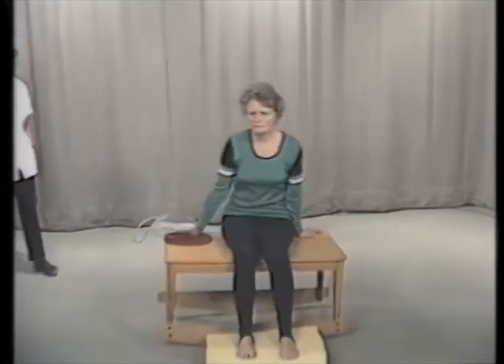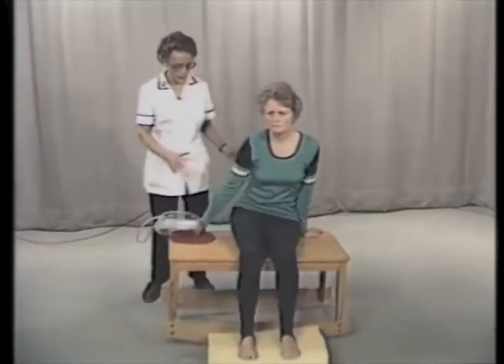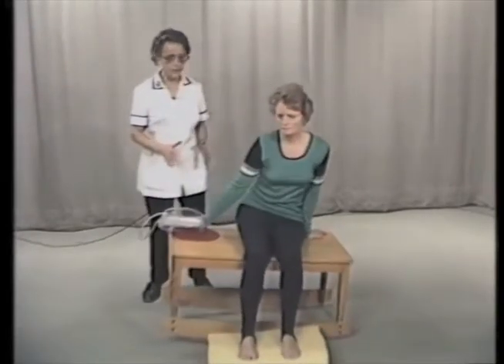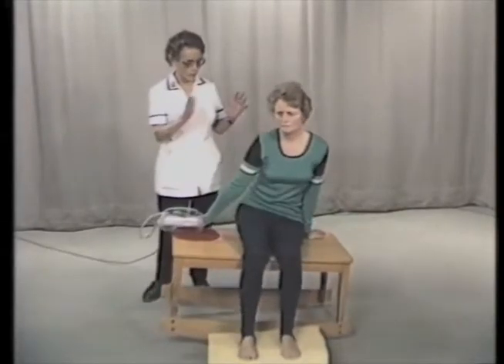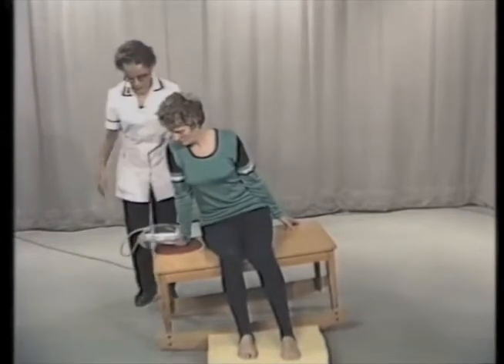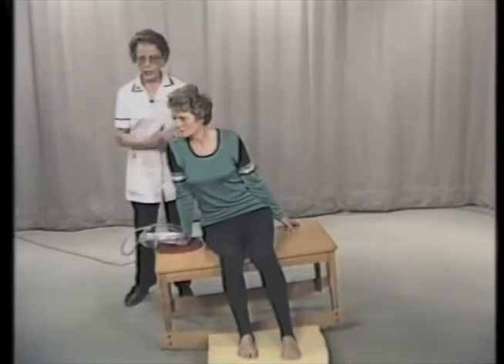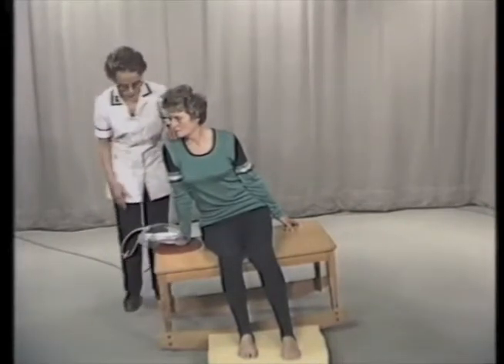Anne is demonstrating that this is a stool on rockers which goes fairly easily from side to side. She's demonstrating the need to re-establish balance through a symmetrical body, in other words, both sides of the body. We find this a very useful piece of furniture, particularly where the patient has difficulty in transferring over the affected side, and that applies to most stroke patients.